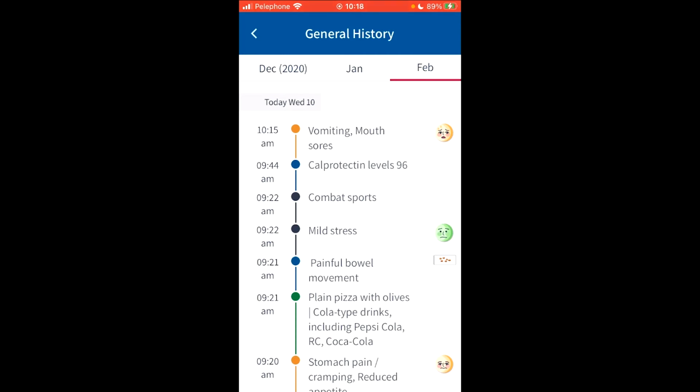So for us, it's a very transparent process where the child can just click the button and then is transferred back when the process is over. And we have a calprotectin level that we can follow up in real time. So this was a short demo. I'm just going to talk a little bit about this, deep linking.